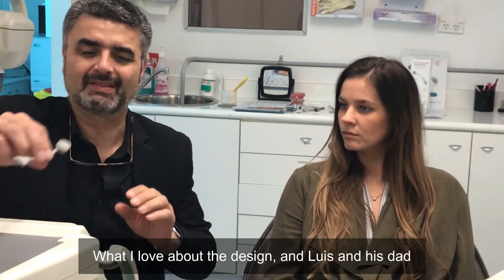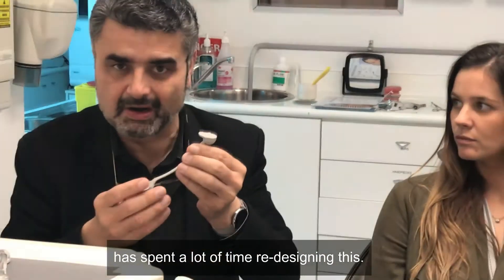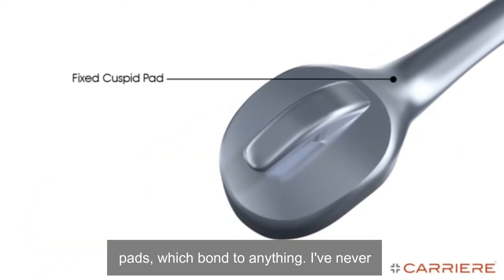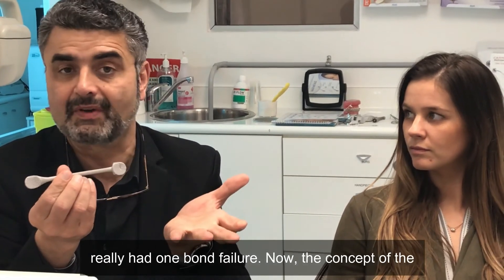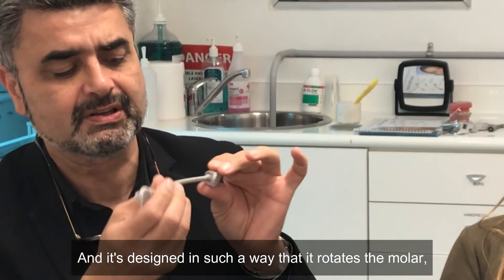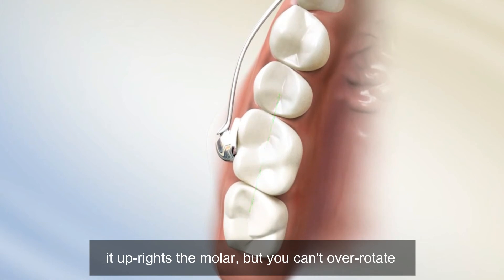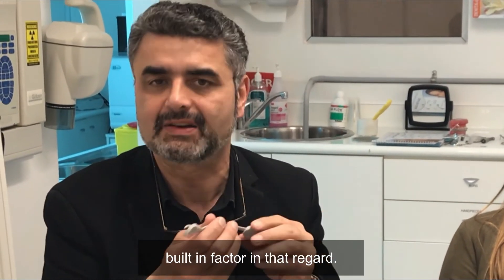What I love about the design — and Lewis and his dad have spent a lot of time redesigning this — but the latest version has these fantastic pads which bond to anything. I've never really had one failure. The concept of the ball and socket joint is much like your hip joint, and it's designed in such a way that it rotates the molar, it uprights the molar, but you can't over-rotate, nor can you over-upright. So it's got a built-in factor in that regard.